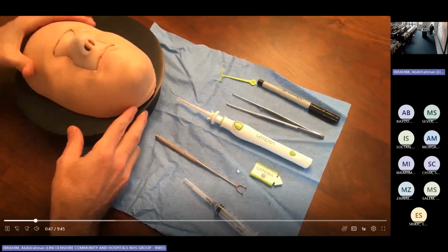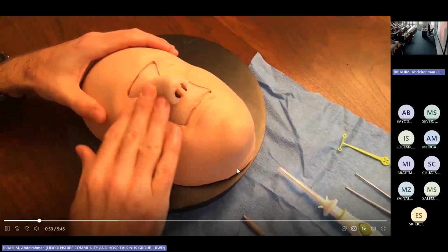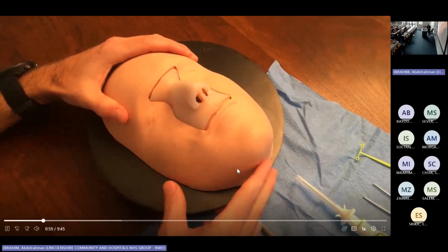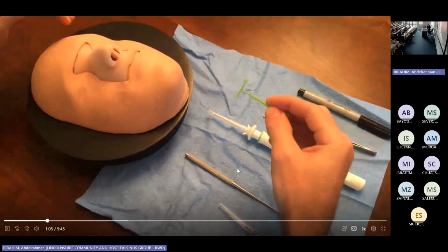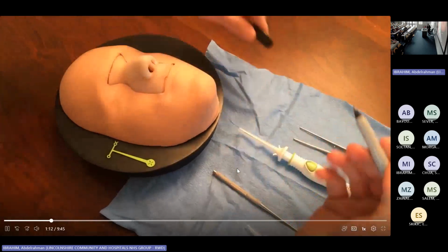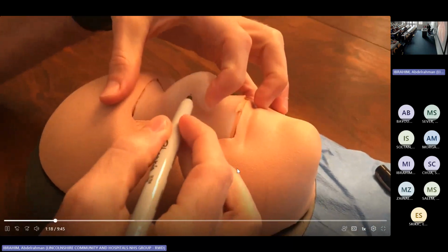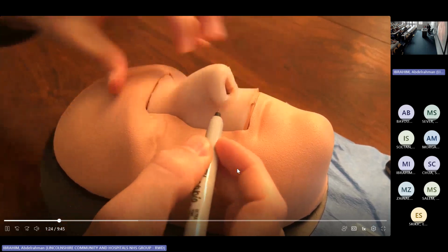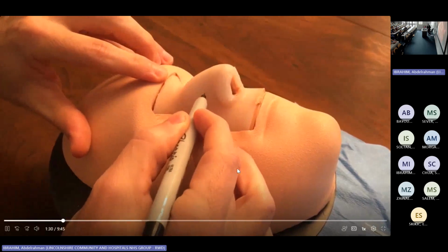The first step is to make sure that you prep the exterior of the nose with betadine, just in case of buttonholing. So prep the nose. The second thing that you'll want to do is start your planning, the 4 Ps. The first step is plan. So with that, I will pick up my positioning guide and my marking pen. I will want to mark the alar rim, the superalar crease. So the superalar crease is right here. I will feel for the caudal aspect of the nasal bone and mark the nasal bone.